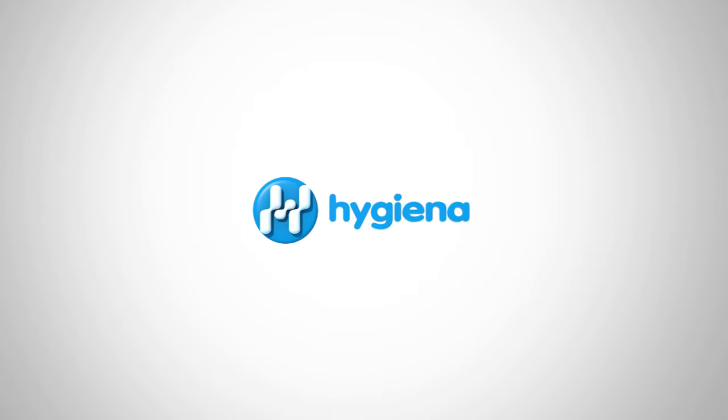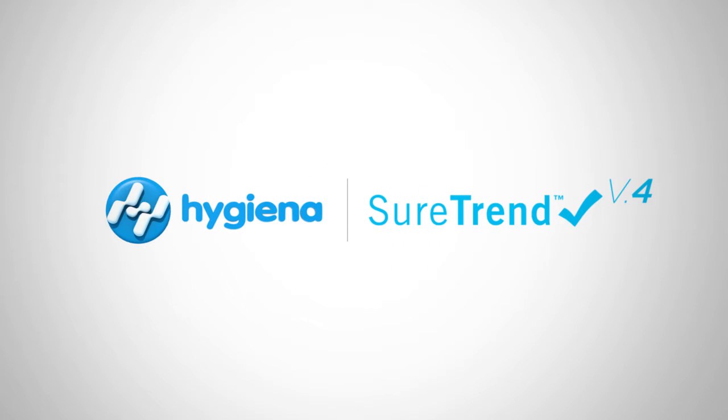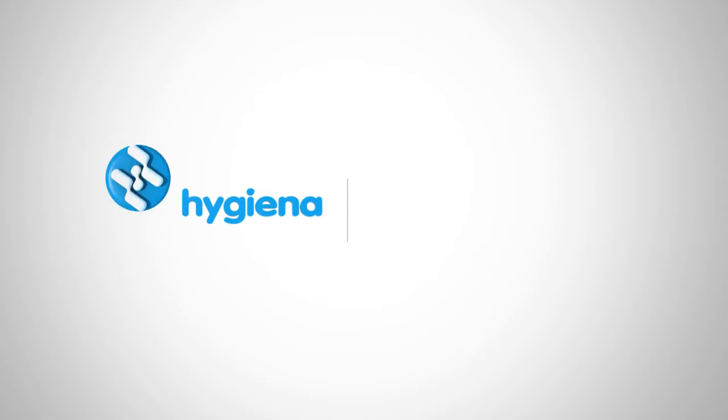Welcome to the SureTrend 4 instructional video series for healthcare. In this video, we will cover adding test locations. Let's get started.